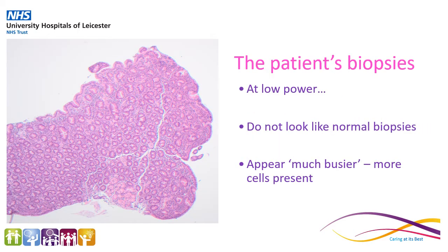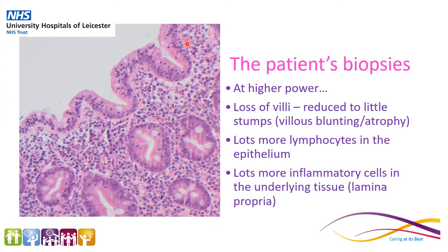This is a picture of the patient's duodenal biopsy, and at lower power we can see that it is not normal. The tissue is much busier, i.e. more cells present, than the normal tissue. And then if we look at this on higher power, one of the most striking features is we've lost those long villi — they've been reduced to these little stumps here. This is called villus blunting or villus atrophy. Also, we can see there are a lot more of the blue dots present in the epithelium, so a lot more lymphocytes present. And within the lamina propria, the underlying tissue, there are a lot more inflammatory cells present.